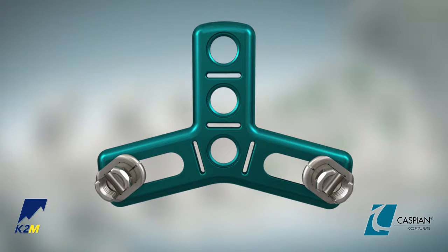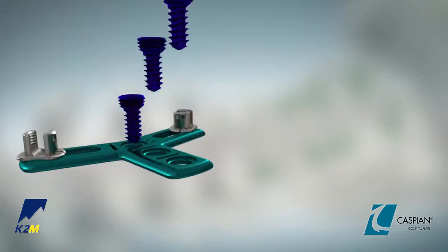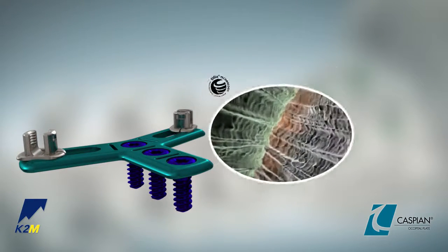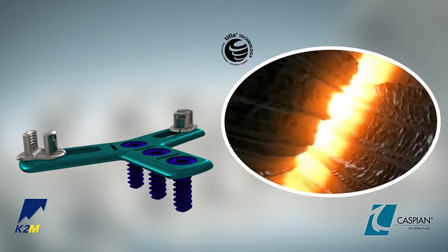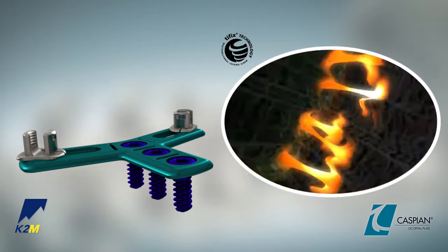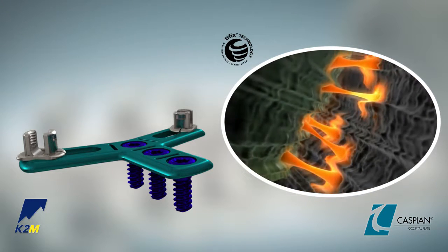This in turn facilitates attachment of the rod to the plate. Further, the occipital plates and the midline screws utilize TieFix locking technology, which allows the screws to lock to the plate upon insertion, eliminating the need for any additional locking mechanism.